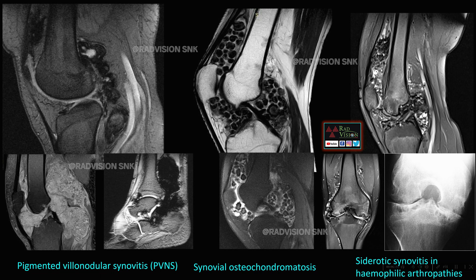Next, three cases all show synovial proliferation with blooming on GRE. Here you can see thick irregular nodular synovial proliferation with significant blooming on GRE. This is pigmented villonodular synovitis (PVNS), showing nodular and villous synovial proliferation with blooming due to hemosiderin deposition.